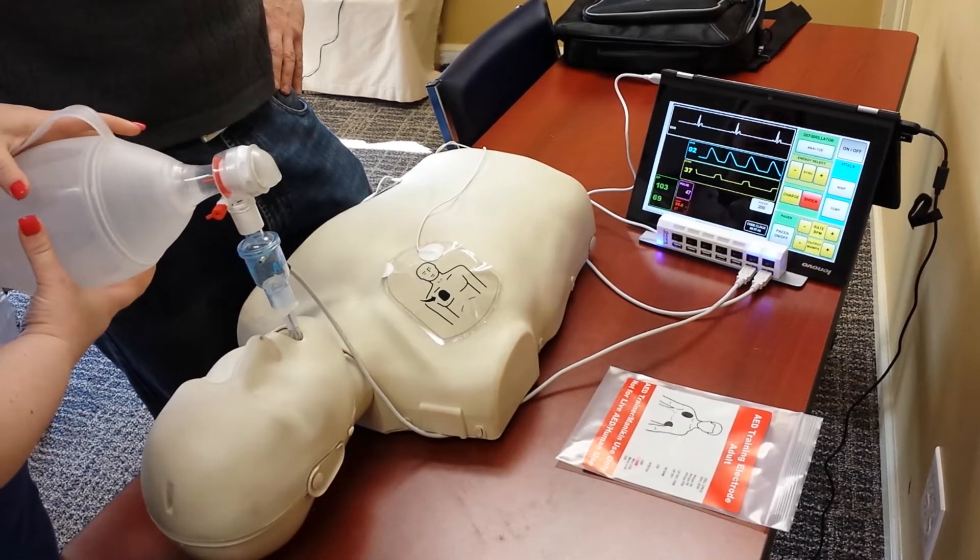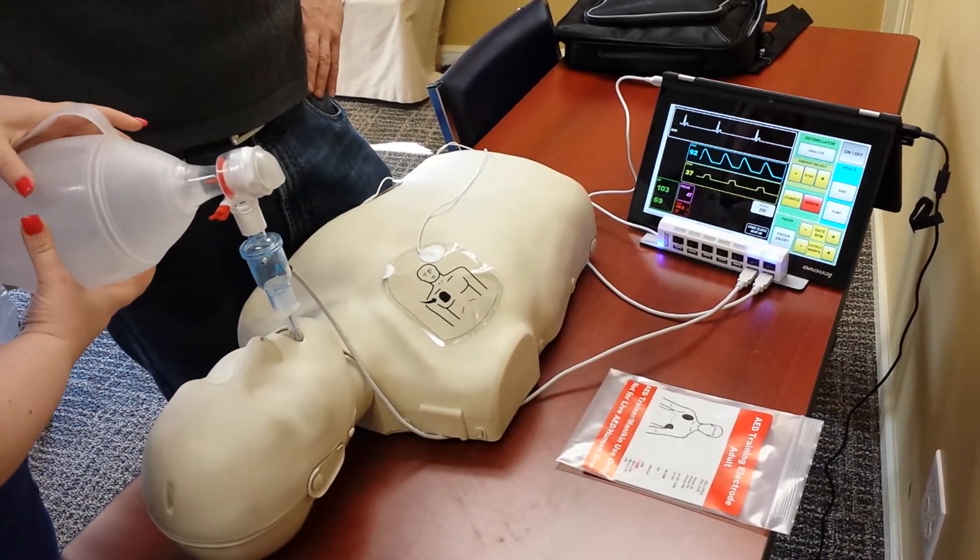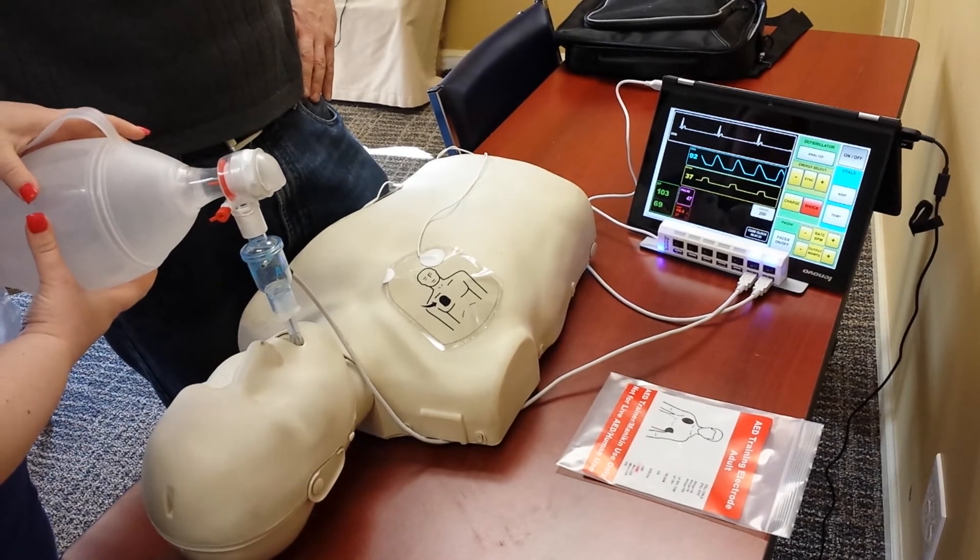37 Celsius. So let's start working on maybe some hypothermia protocol. Let's get some saline in him and we'll recheck the temp, see if we can get it down to 32 or 34 degrees Celsius.